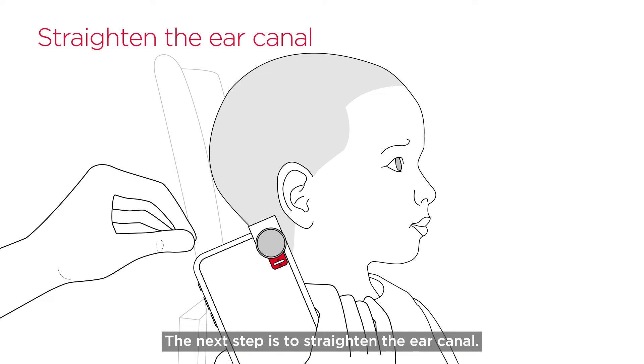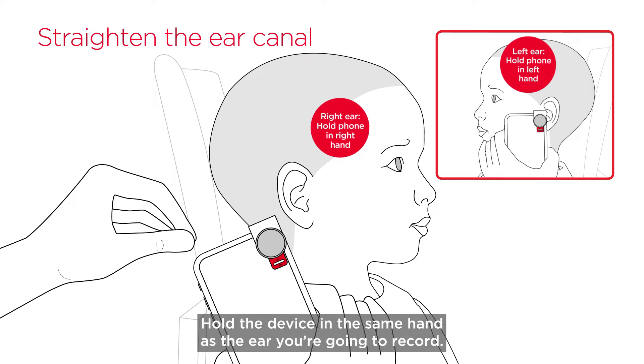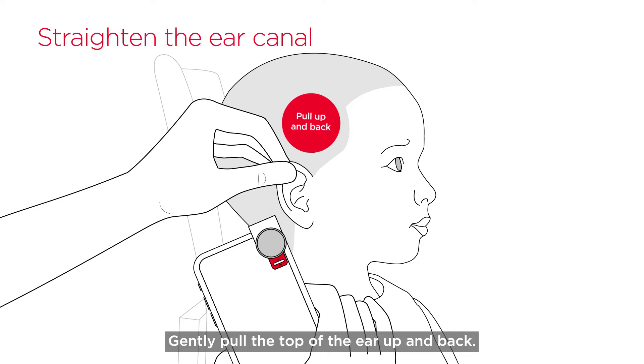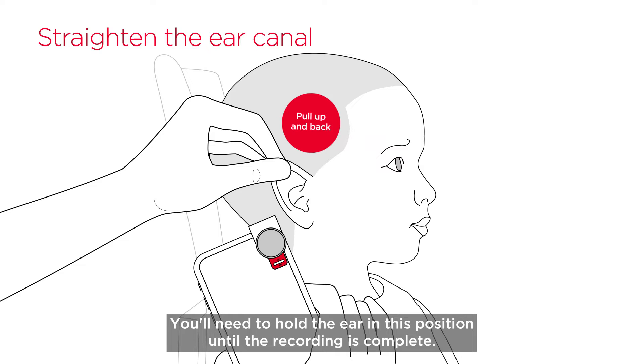The next step is to straighten the ear canal. Hold the device in the same hand as the ear you're going to record. Use your free hand to position the ear. Gently pull the top of the ear up and back. Most ear canals are slightly curved, so this important step helps straighten the ear canal so you can record the entire eardrum. You'll need to hold the ear in this position until the recording is complete.